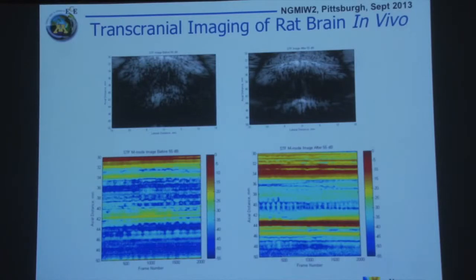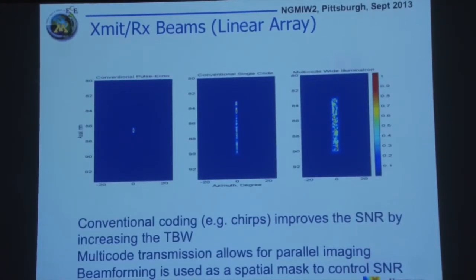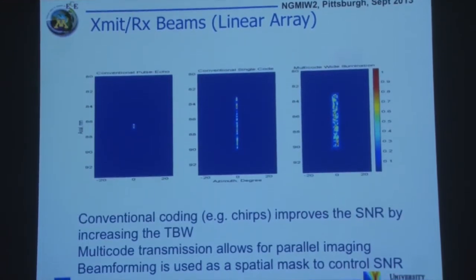So this is exciting, that these types of arrays give you the sensitivity to go down to low scattering data from blood flow. That's as far as motivation. I'm trying to motivate our approach to using more advanced imaging techniques, both for the reconstruction but also for the excitation, so that we get more specific responses.